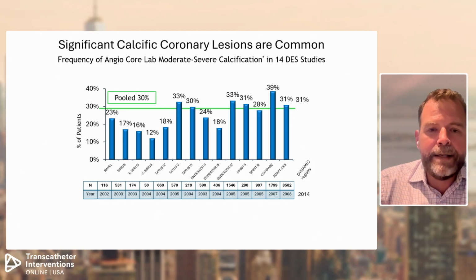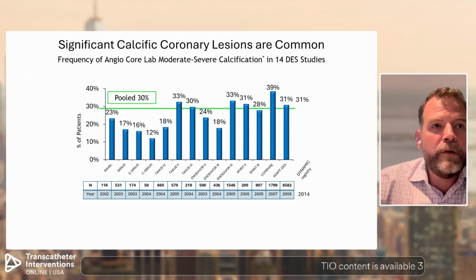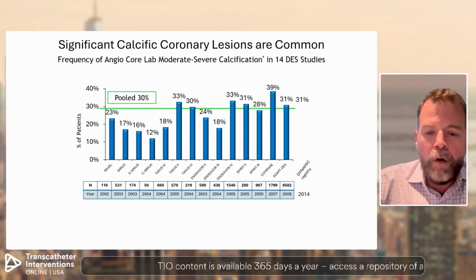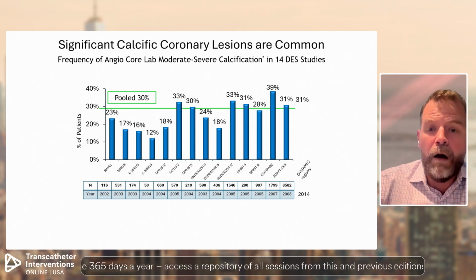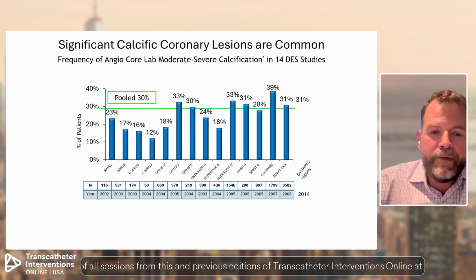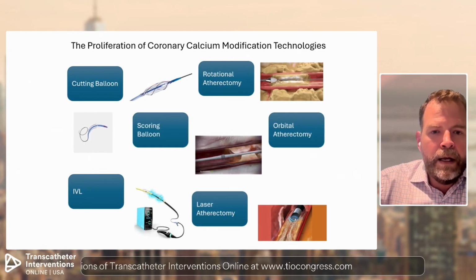baseline, is we've seen this slide time and time again, but it's really moved. Calcium modification has moved from very niche stuff when I first started at the universities to over a third of our patients having moderate to severe calcium, and so it's something we all have to deal with. It's a lecture that we all have to listen to, and we all have to get sorted. It's not something that we can defer to others.